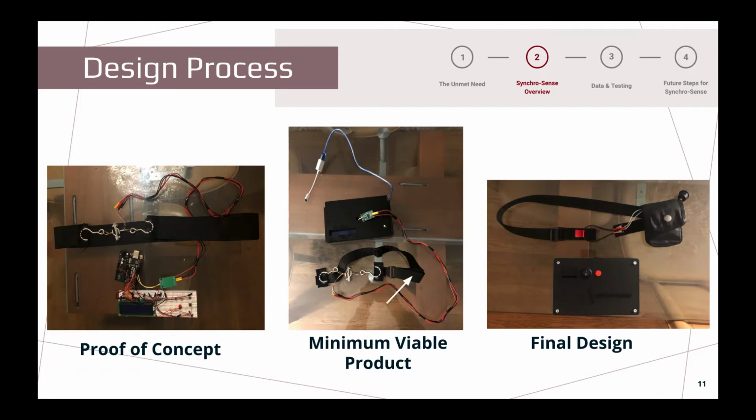However, the box and the sensor are still connected by wires, meaning the X-ray technician would need to be right next to the patient to use our device. This is not ideal since the technician still has to operate the X-ray machine from a computer, which is often on the other side of the room. In our final design, we fixed this logistical issue by adding Bluetooth functionality to our device so that the sensor can communicate with the device wirelessly.